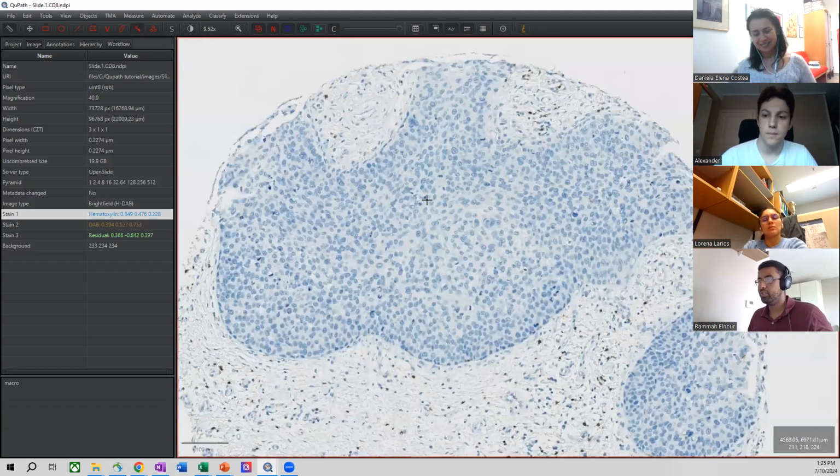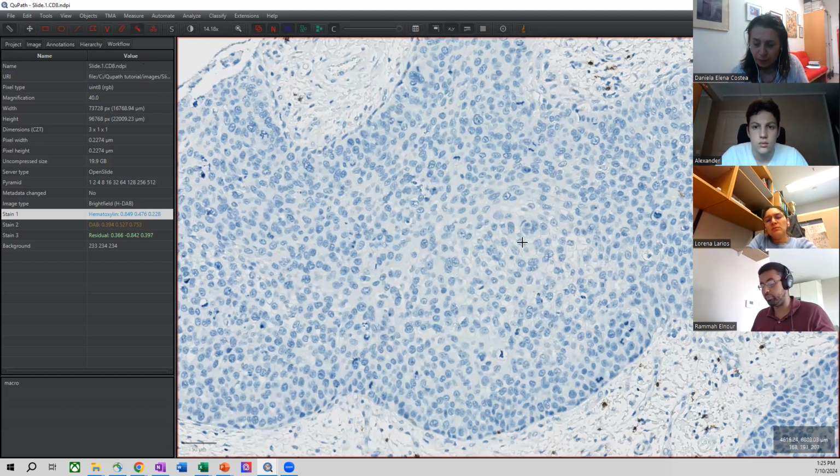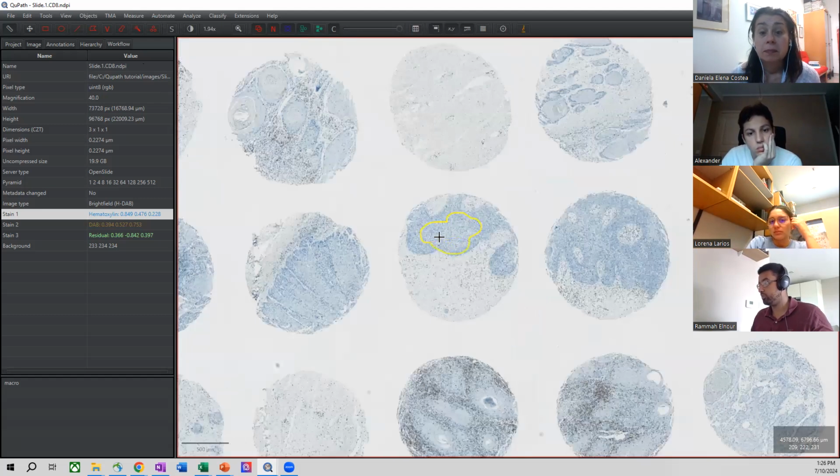Yes. So my favorite tool to use within QuPath is probably the brush function. For the brush, you would use the keyboard command B. So you just press B on the keyboard and use the brush function. It looks something like this. But if you pan out, the brush stroke becomes even bigger, so you can potentially cover even more area. If I pan out, you can make it even bigger.